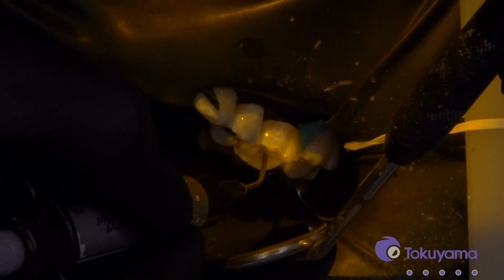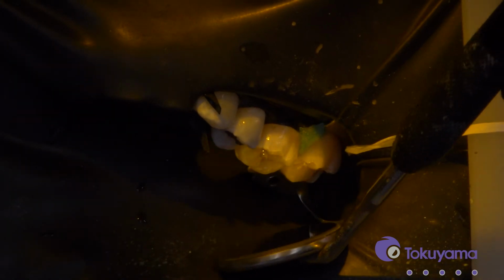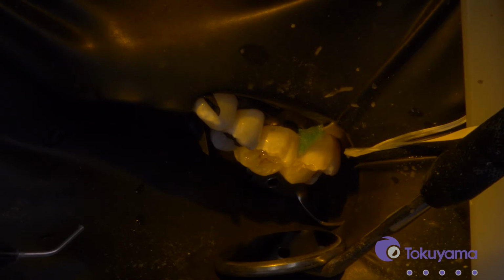This is a great material also because it has the ability to self-level itself. So when you're applying it, you'll see that it will kind of creep into some of the nooks and crannies that we need. There are probably a couple of other areas here where I'm going to add another increment, but go ahead and cure.